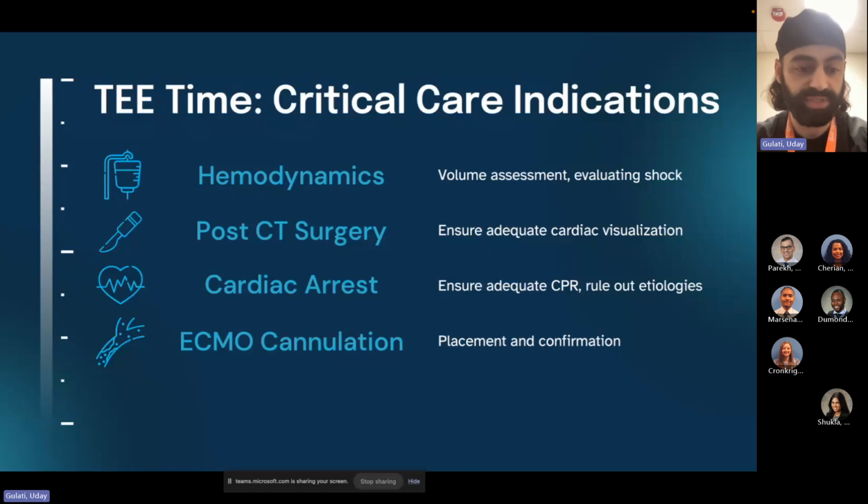In a lot of our patients, we're going to have to do it serially, right? More and more, I do agree that there's still some utility in the Swan Ganz catheter, the PA catheter balloon, but I think it's far less useful compared to good ultrasound images, especially if you can repeat them with similar accuracy and then get serial measurements that way, right? And so now imagine just having a TEE probe in and getting your serial assessments that way, deciding whether your interventions are improving the patient's overall cardiac output, the patient's overall shock state.